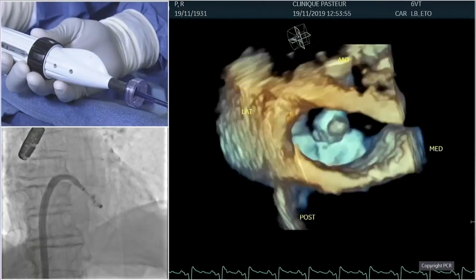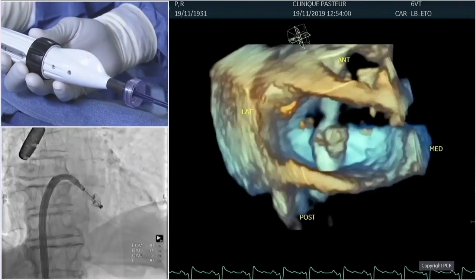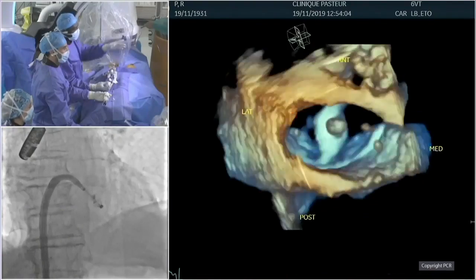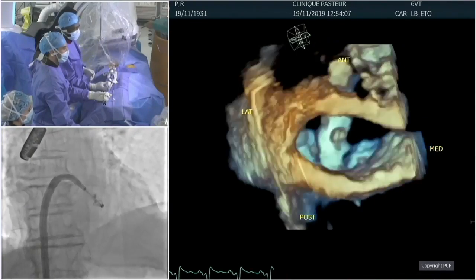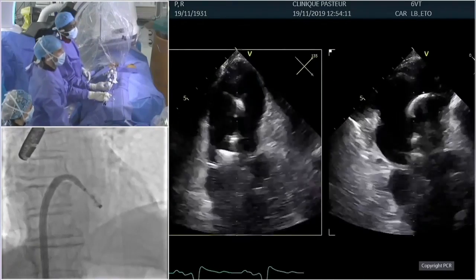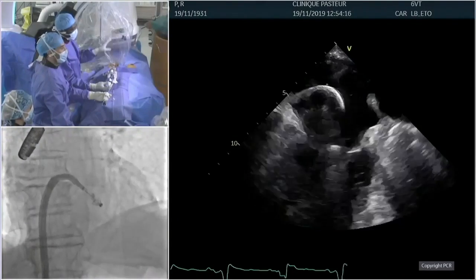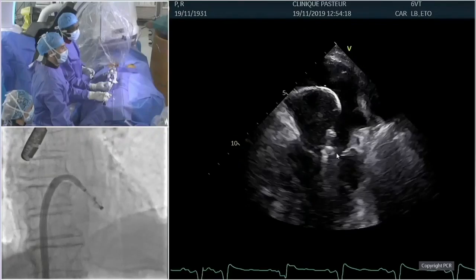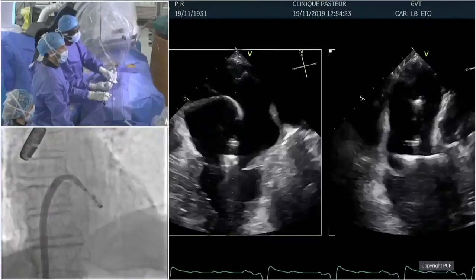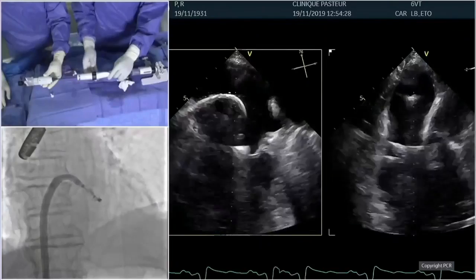Okay. So let's come back to the fluoro. I always like to record to see what the aspect is once we have it on fluoro. Okay, we're a little bit close to the valve. That's why we have such a movement. Okay, let's go back to the X-plane, guys. And maybe once again on the X-plane we can put another run of color just to see where the jet is, if we are happy with the position. I'm going to back off a little bit here because we are touching the mitral valve and it's going to be more obvious for you.